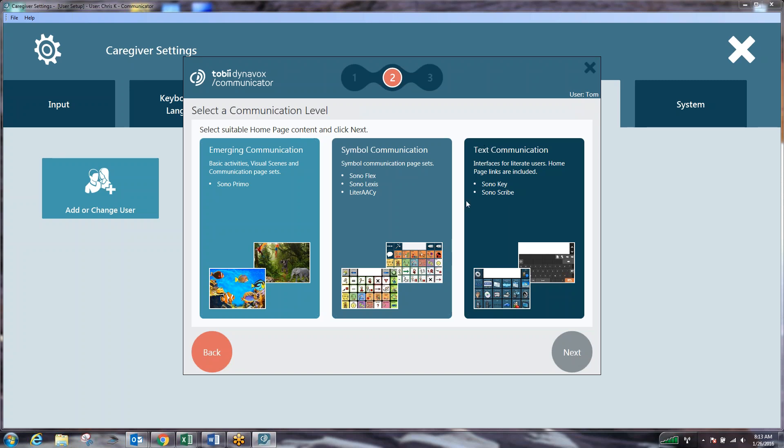And the final step is text communication where we use things such as Sonokey, Sonoscribe, standard QWERTY keyboard and programming in full text messages, not really utilizing any symbols or cause and effect. This is really more of a keyboarding based area to function. So we're going to choose text communication and hit next.